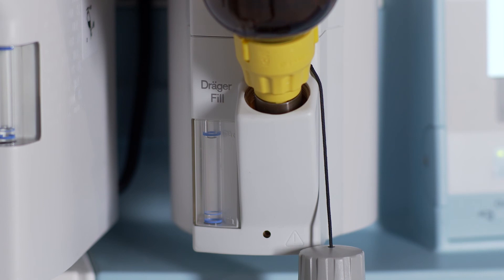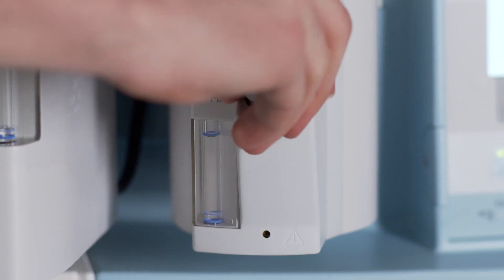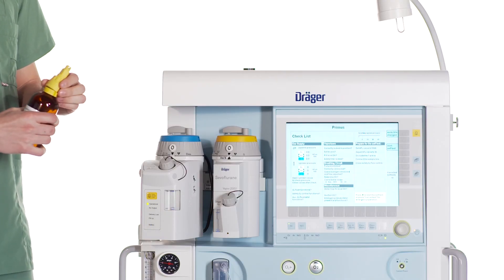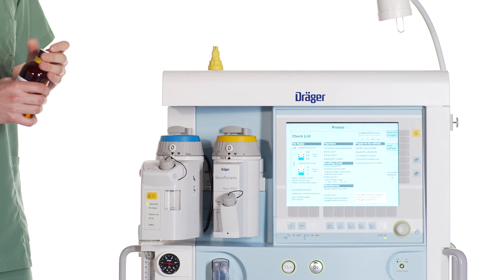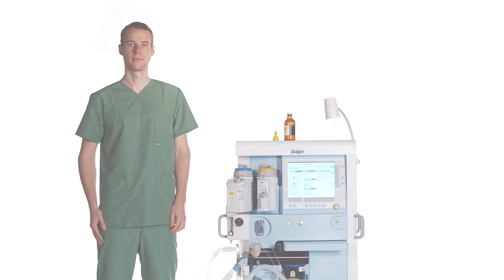Once the filling procedure is completed, release and withdraw the bottle slowly. Screw the cap onto the filling opening. Unscrew the Drega fill filling adapter from the bottle. Close the anaesthetic agent bottle. Please set the Vapor 2000 control dial to the desired position.